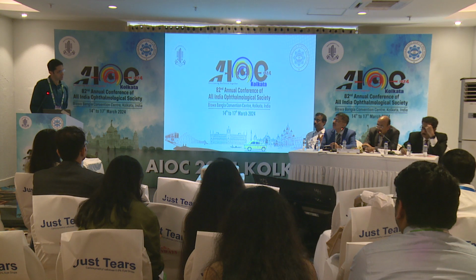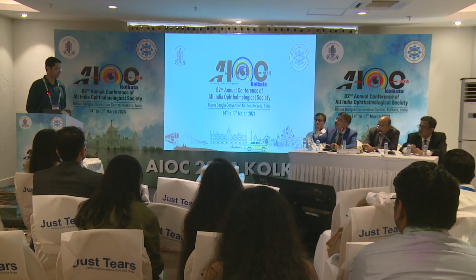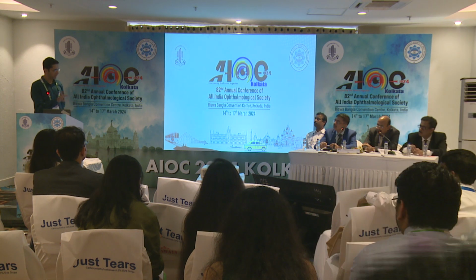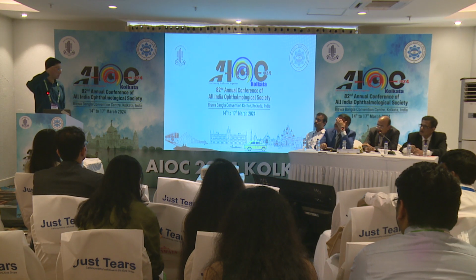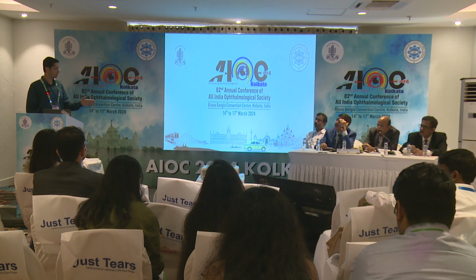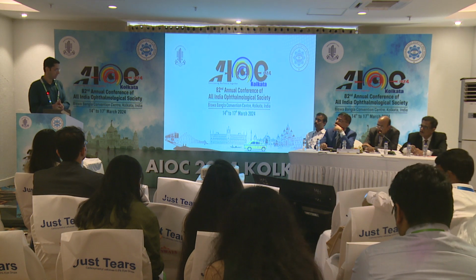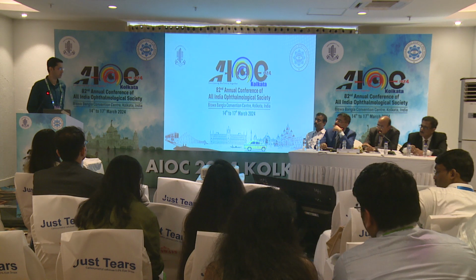Who's the company? Remidio, sir, Remidio. And the AI software? They have collaborated with a US company, and they have developed the software. I saw a large number of AREDS images. Yes. We took patient permission, and they analyzed the images with the trained software. Then they analyzed in different centers in Bangalore and others on Indian patients. Once it was validated, the study came to our center, where we tested it against the gold standard of 3 retina consultants to validate whether this applies to our patients or not. So we did the last part of the study. The initial part was already done by the company.